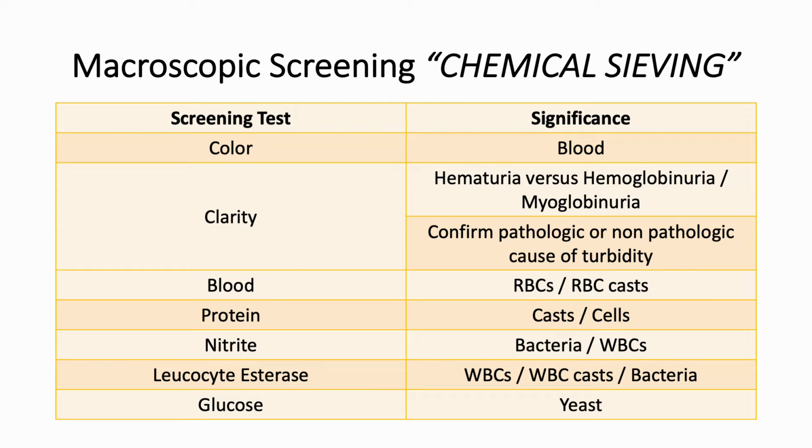Microscopic examination of the urine sediment is said to be the least standardized and the most time-consuming part of routine urinalysis. To enhance the cost-effectiveness of urinalysis, many laboratories have developed protocols whereby microscopic examination of the urine sediment is only performed on specimens meeting specified criteria.